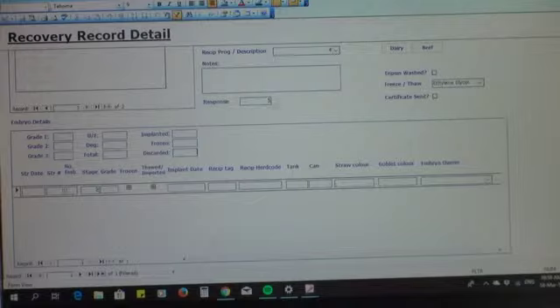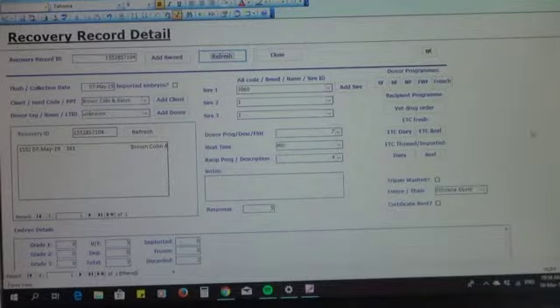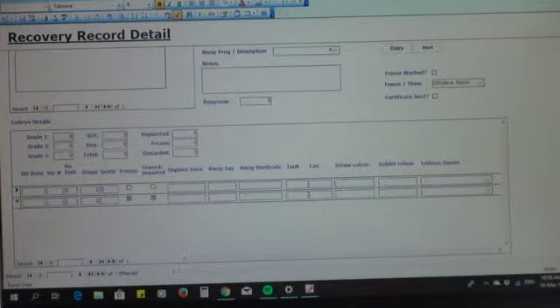Okay, so then we collect the embryos. In this case, I think there's going to be 5, and let's just imagine there is 5. So there are 3 unfertilized, let's say. That's stage 1, and they're not implanted because they're discarded. I think if we jump up here and refresh, the system has recorded them as discarded. So the system has recognised that they're unfertilised because they're stage 1 and said they're discarded.